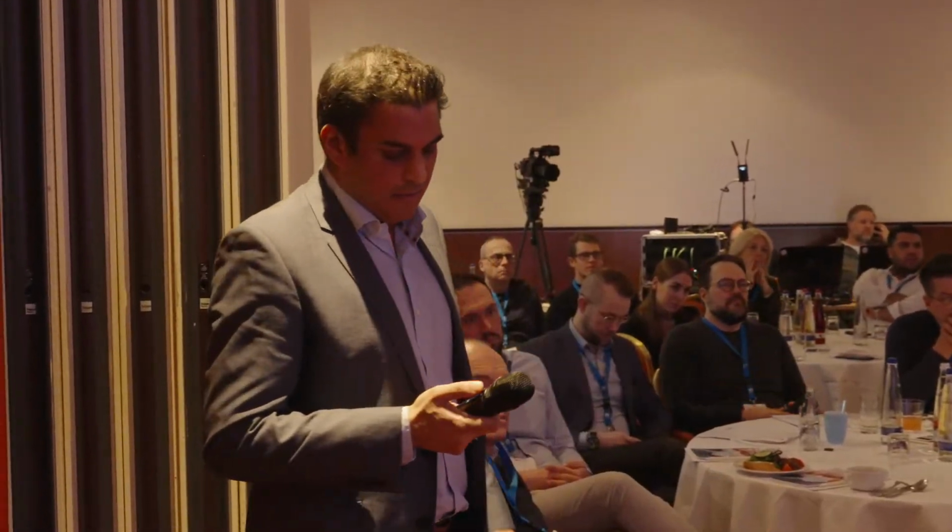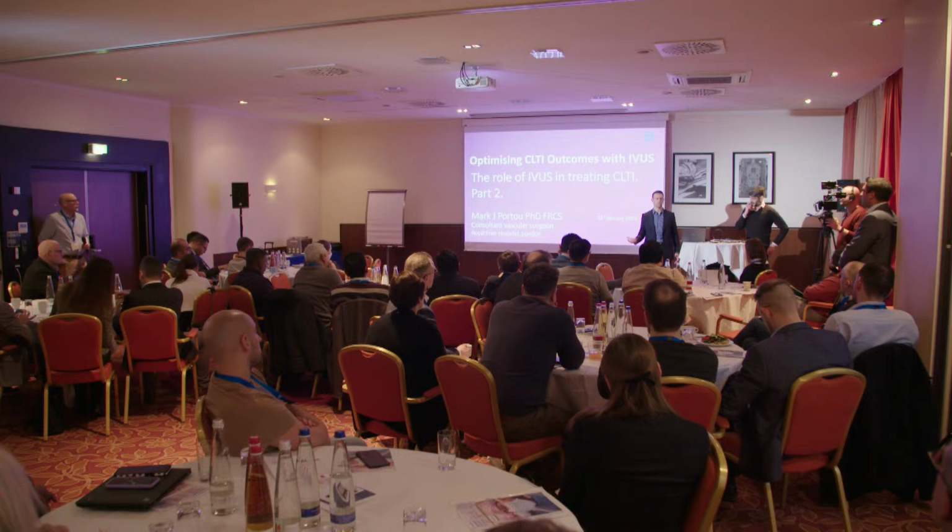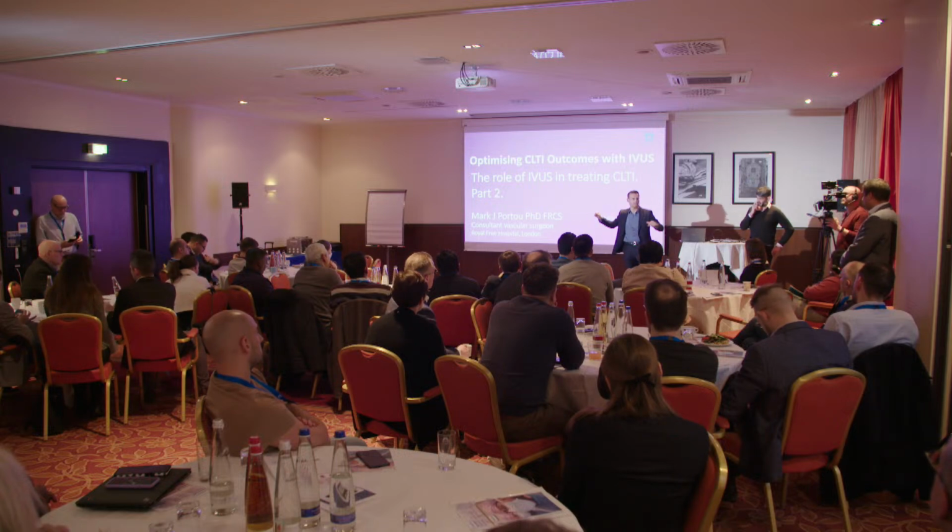Mark, I noticed that you've got a great setup, even though you've got a very small space. Can you give us an insight into how you worked out where to put the IVUS machine and then your touch screen, and what works, what doesn't work? So it's all about our visibility as the operator. First and foremost, it's about our ergonomics. We need to be able to see it, and this is where the touchpad really helped. It wasn't just about my ability to drive it, measure RVD, and record the pullbacks, all these things that we want to be able to do without relying on somebody outside of our operating field to do it for us.